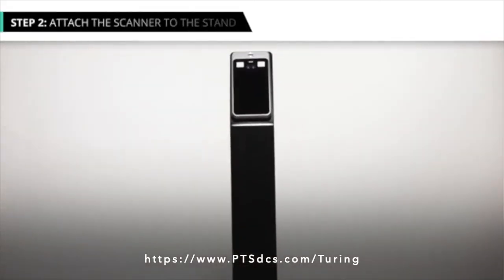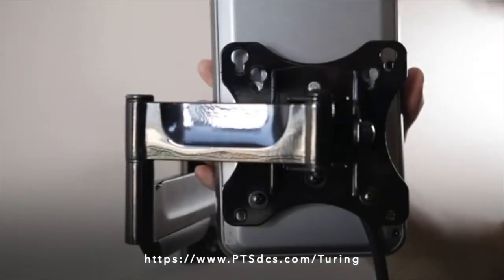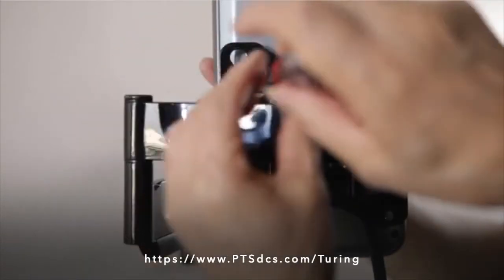Your package may have the scanner already attached to the stand. If not, simply follow the steps in the operating manual to fix the scanner to the stand. For example, for a wall mount, use head screws to attach the scanner to the mount.